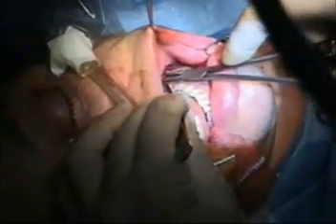A two-layer closure is performed, bringing first the buccinators muscle together and then the mucosa to provide a watertight seal. This patient underwent augmentation of his mandibular angle, body, and ramus.